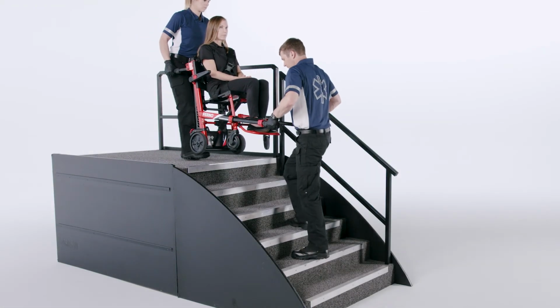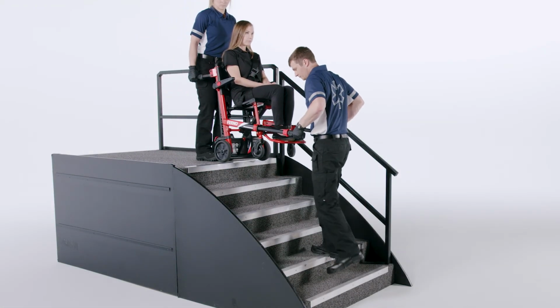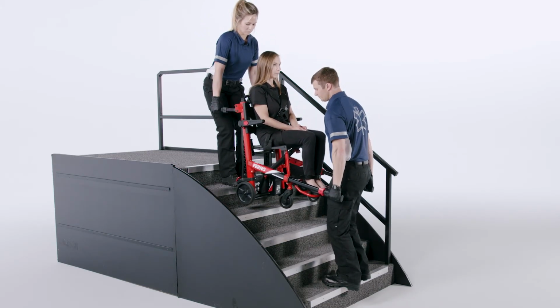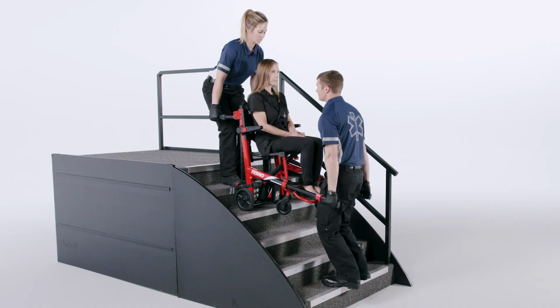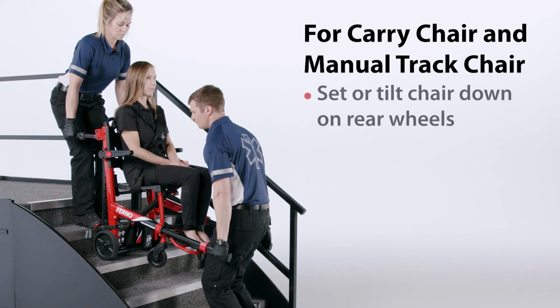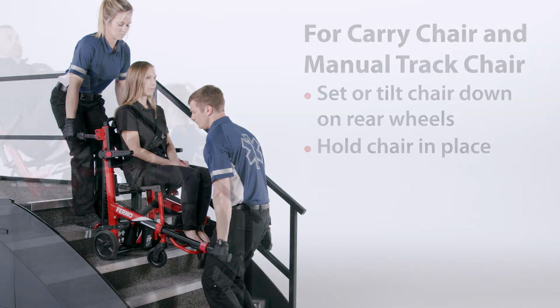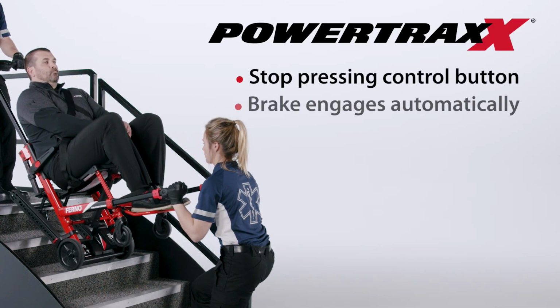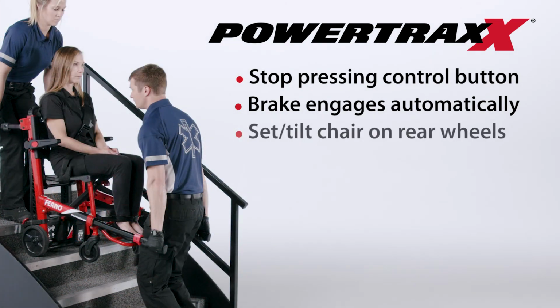If the operators tire or need to attend to a patient during a transport, either pause with the chair in the reclined position or tilt the chair up to rest on one of the steps to attend to the patient. For the carry chair or manual track chair, set or tilt the chair down on its rear wheels on a step and hold the chair in place. For the PowerTraxx chair, stop pressing the control button and the brake will engage automatically. Then, tilt the chair down on its rear wheels on a step and hold the chair in place.